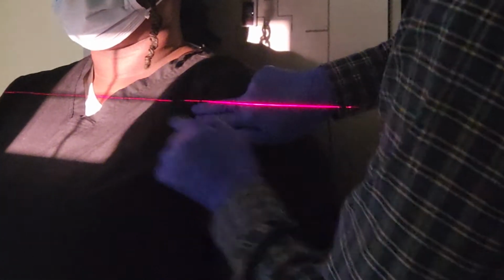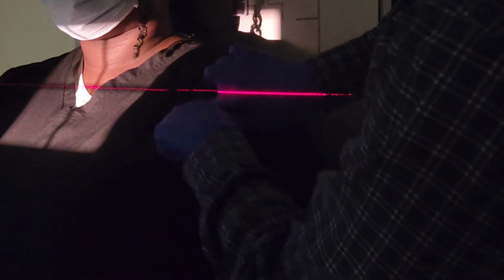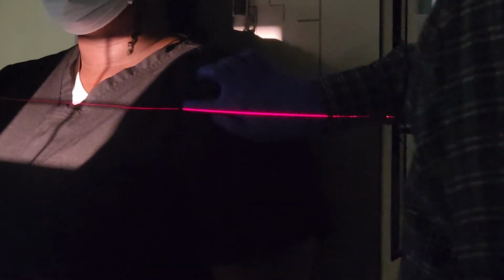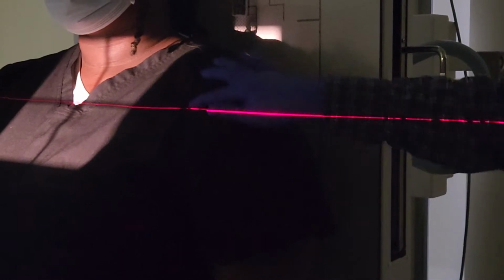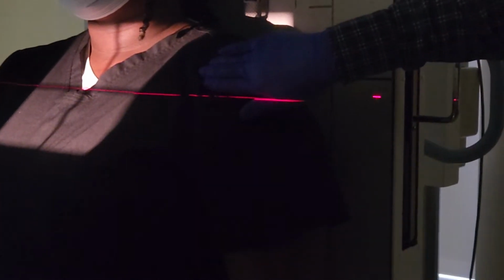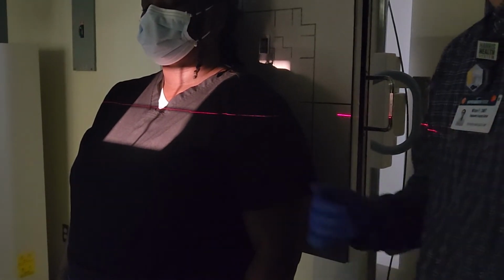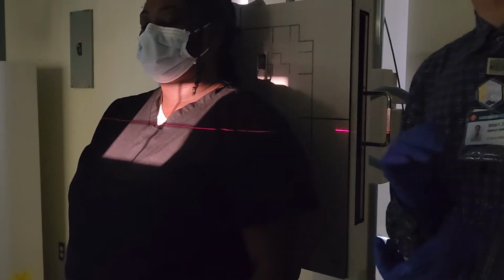So instead, I'm going to take the clavicle here, follow it up. All right, AC joint, go down 1 inch. Okay, so that's about the height of my coracoid. From here, go down 1 more inch. So this should be about the height of my centering. I'm just going to drop it down right about here. Okay, so from AC joint down here is about 2 inches. So since I can't find a coracoid right now, I'm just going to have to estimate.